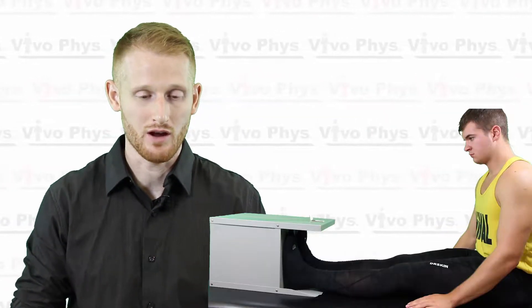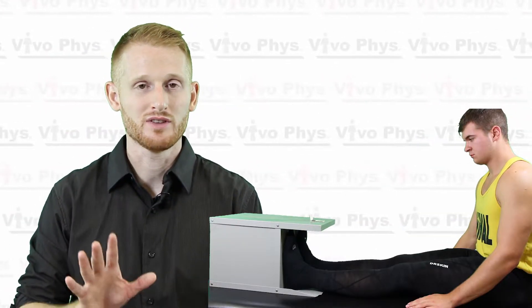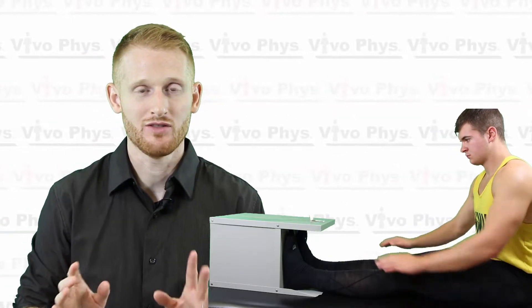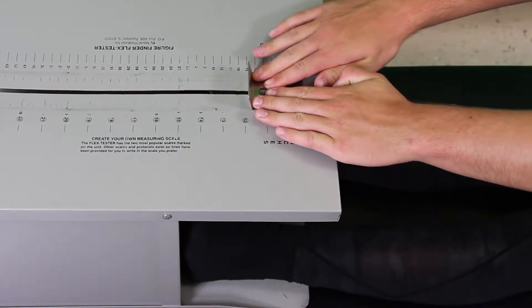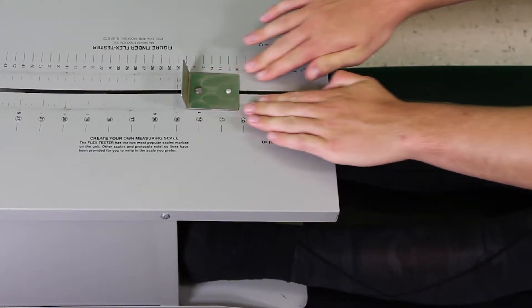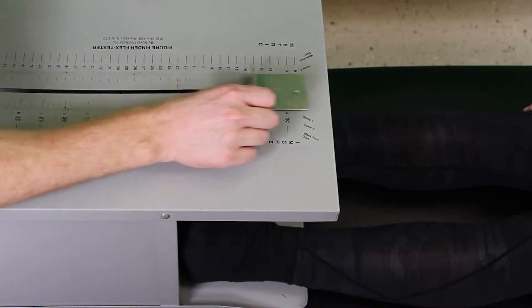Once you've done that, have the person lay down on the ground or on some sort of exam table and put the sit and reach box in front of them. They're going to put their feet into the box all the way against the wall, then slowly stretch down until their hands come in contact with the piece of metal on top of the box. They stretch as far as they possibly can, pushing that piece of metal along the measuring scale. When they can't go any further, they stop and relax back into a seated position.